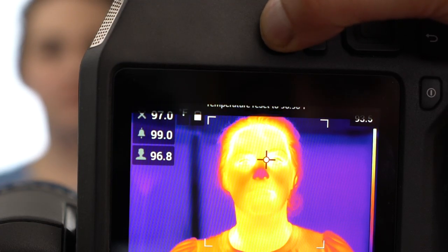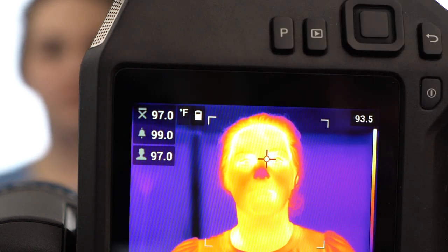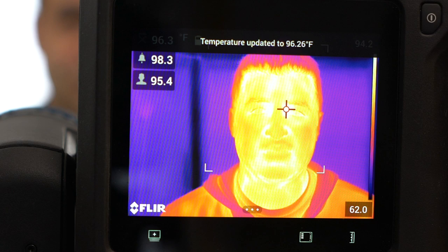A long press of the P button resets the baseline temperature. A short press of the P button averages in a new sample. It's recommended to average at least three samples from healthy individuals. The camera can store up to the last 10 samples.